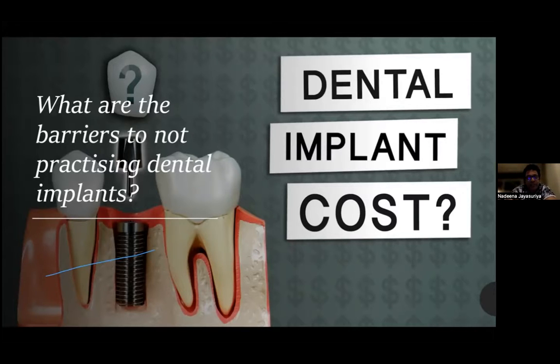The next barrier is the cost. You will have to invest in dental implants, the implant machines, the toolkit, and try to invest in a reasonably good implant when you're starting. That's why I told you, if you go for the cheapest implant, sometimes the failures and problems might really demotivate you. So think about what kind of implants you're using when you start the implant journey.